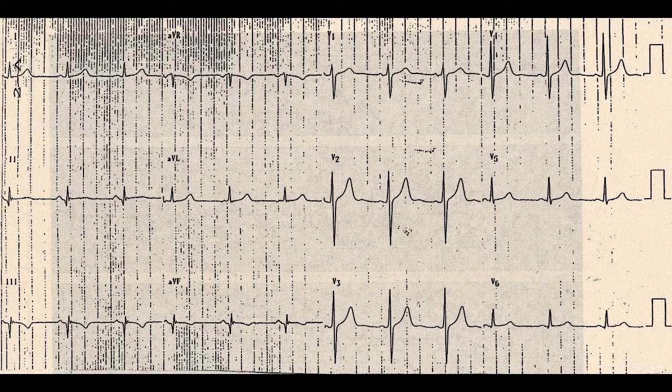But then mathematically you have to convert too. Those are the only 2 other possibilities. I wouldn't get too concerned about that at this point. Just the main idea here is the normal standardization is 1 millivolt equals 10, and again, it's just setting up the machine to give you the right wave height from that.